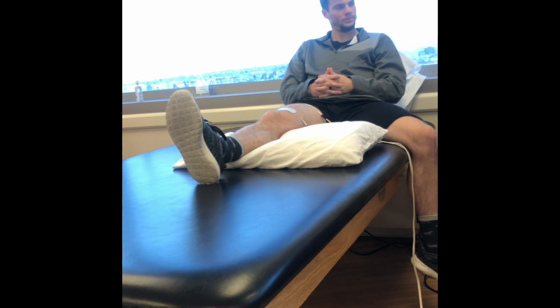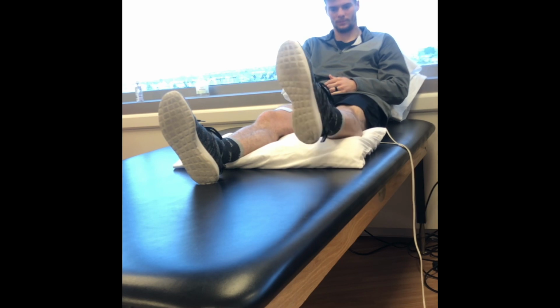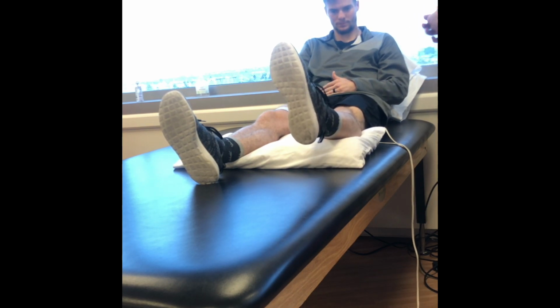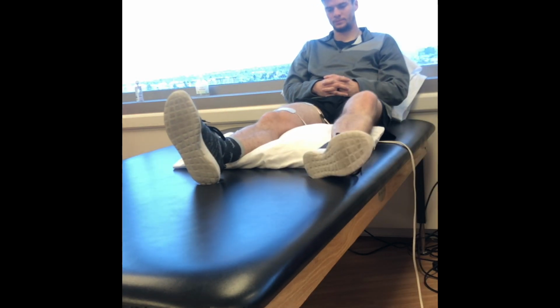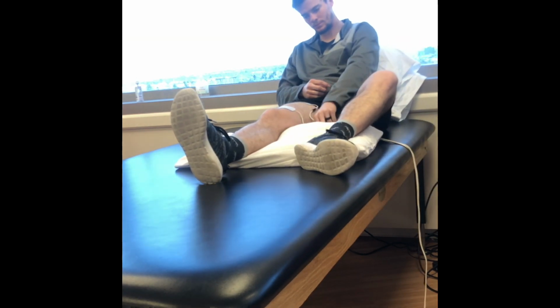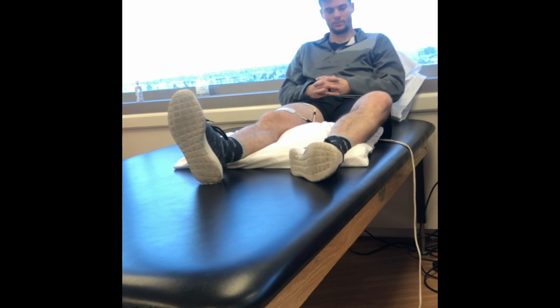All right, so go ahead and communicate with me. Once you start feeling a buzzing, I'm going to slow down, but we want this to be a pretty good contraction. So I want you to bring this leg up, and I want you to just flex your quads as hard as you can on this leg, and this contraction should be about 50% of what you're getting on that leg, okay? All right, so I'm going to go ahead and start ramping up here. So tell me when you first start to feel the buzzing. Feel buzzing? Okay. Now I'm going to slow down, but again, we still want a pretty intense contraction there, okay?